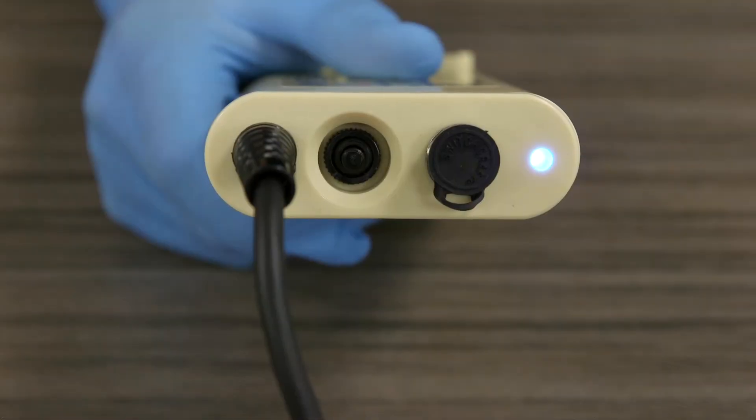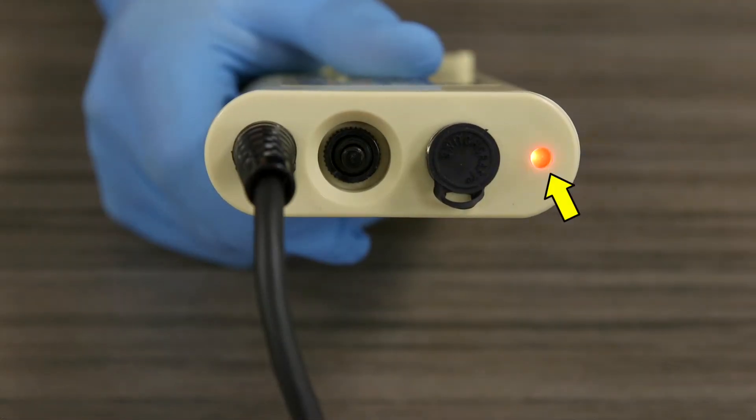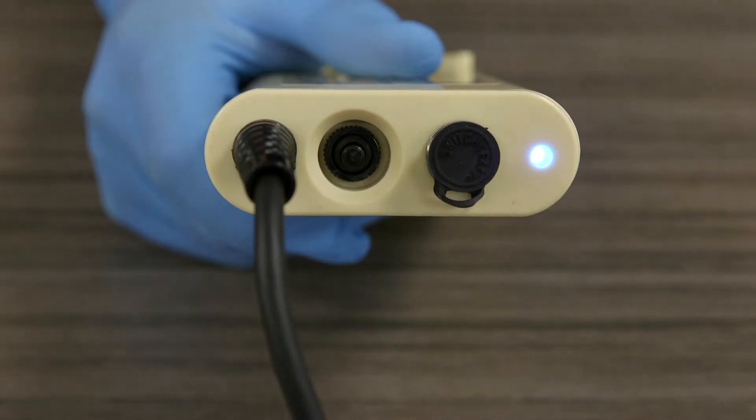Observe the LED on the battery housing. The LED is blue when the battery is powered on. The green LED on the heater unit will flash with each heating cycle. During an alarm condition, blue and red LEDs will flash and an audible alarm may be heard. For questions about alarms, refer to the alarms and alerts section.